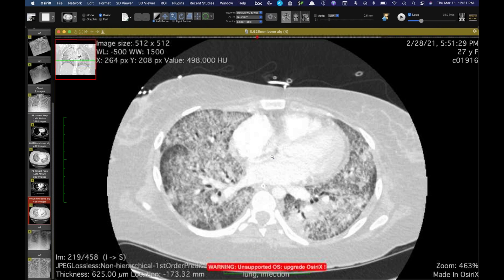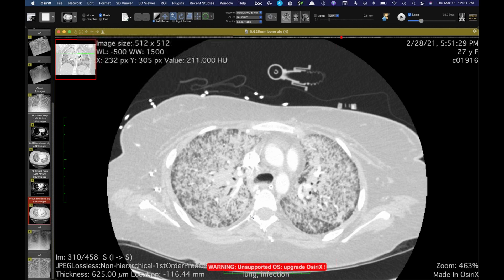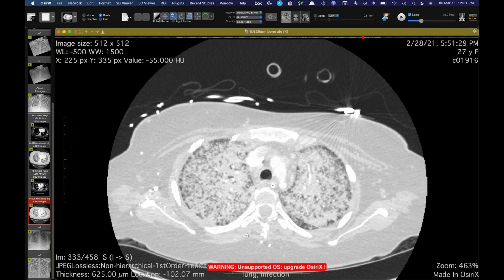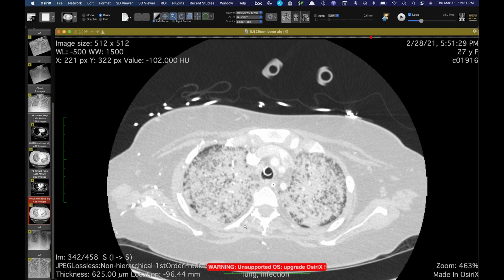You can see she's breathing through the lower lobes but there are diffuse little micronodules that coalesce more in the upper lobes. She is of Central American descent, and this is all disseminated coccidioidomycosis. She has not responded. A month later she's still breathing hard and if anything it's becoming more confluent — she was not yet intubated at that time. She's been on multiple antifungals without success. On a more recent CT, now she's intubated and clinically meets the definition of ARDS, and you can see some bronchial dilation from an organizing phase of lung injury.